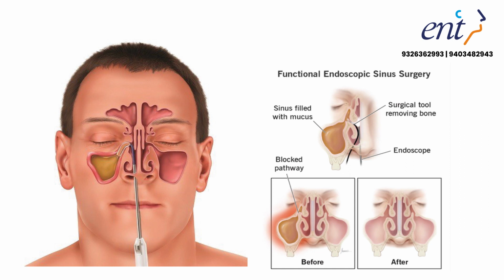and the airway should be patent throughout. So the primary purpose is to make the nose and sinuses a ventilated cavity. That's why it is called functional surgery, because it is done endoscopically and it is to make the function of the nose and paranasal sinuses proper.